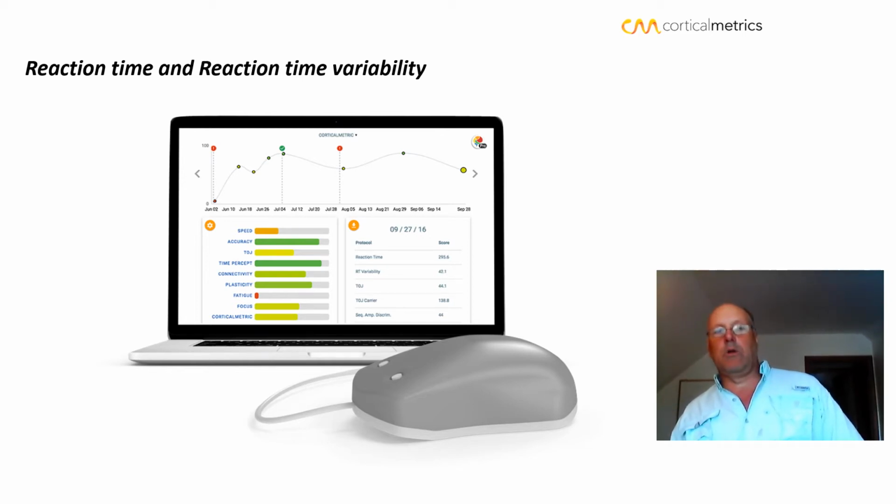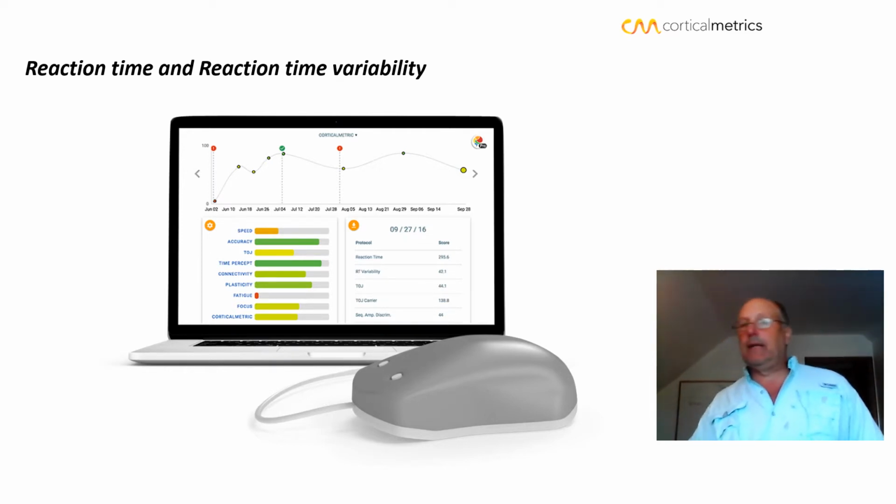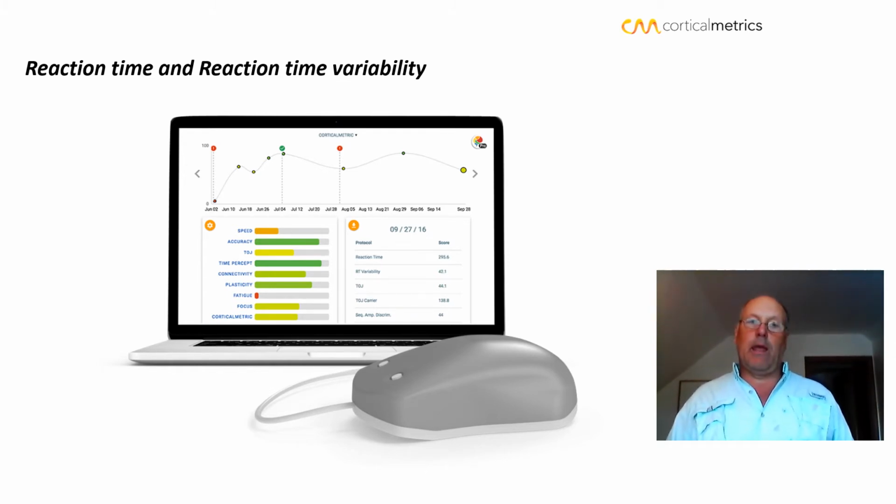I am Mark Tomerdahl, and this talk is about reaction time and reaction time variability. Reaction time is an extremely easy concept. You receive a stimulus on your finger and you respond right away. Generally, the Brain Gauge delivers a stimulus to the first digit and you respond either on the computer mouse, or if you have a Brain Gauge Pro, you can respond on the Brain Gauge Pro.